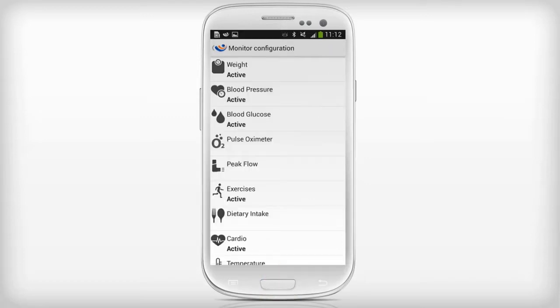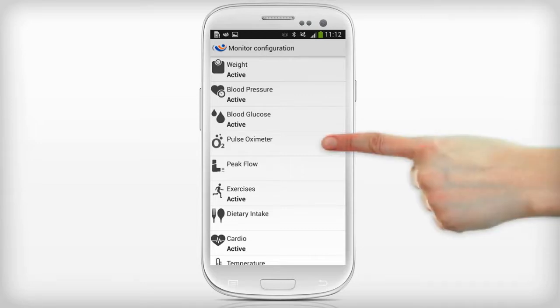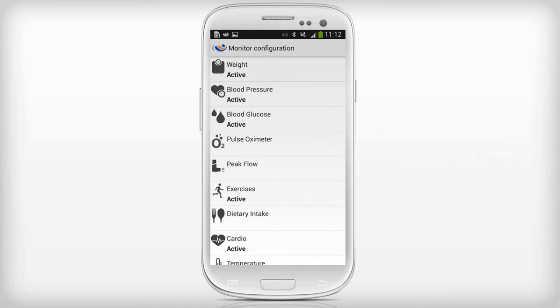On the monitor configuration screen, click on the name of the monitor you want to use. We chose the pulse oximeter. Other monitors can be configured using the same steps.